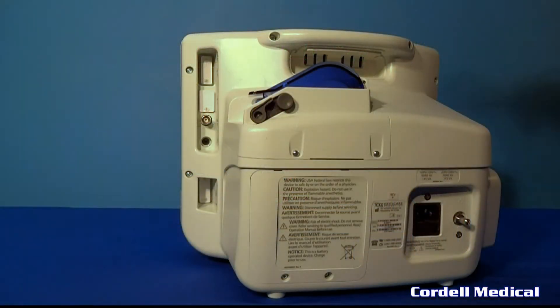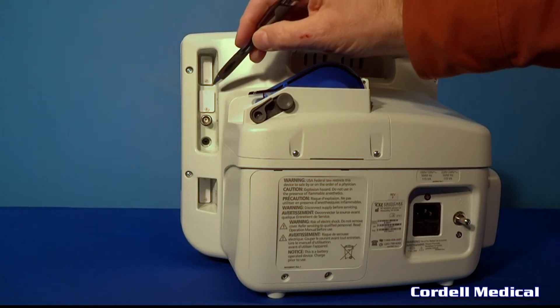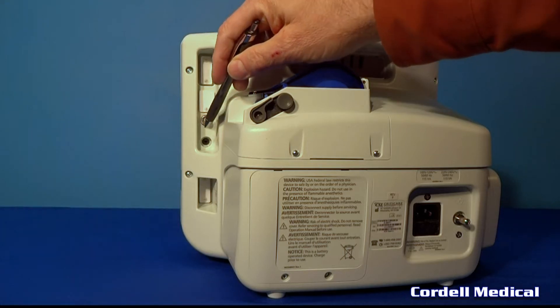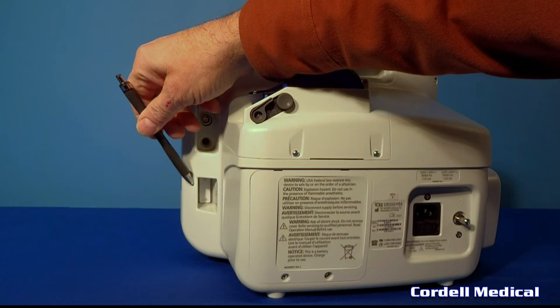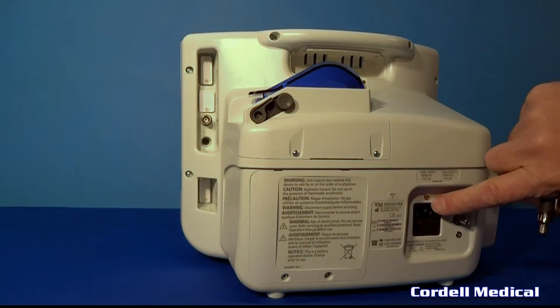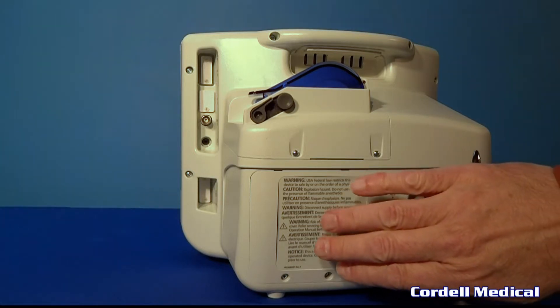On the back of the monitor there is a port for electronic medical records, factory software port, ECG output, nurse call interface, and a DB15 video port for flat screen televisions. This is the AC power connection, the chassis ground, and battery door.